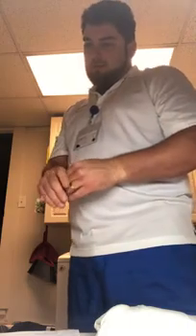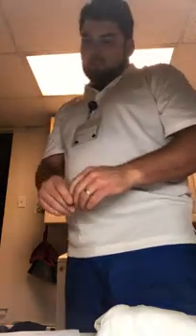Very good. So make sure the room's safe. There's no clutter, no spilled water, table's out of the way. The bed's locked in a good position. We're gonna pull the curtain shut, wash my hands, and so the reason I'm here today is we're going to be doing 2 injections for you. It shouldn't take too long.